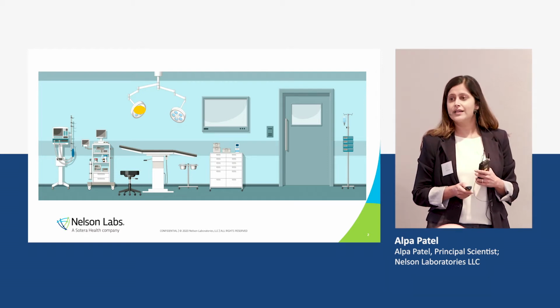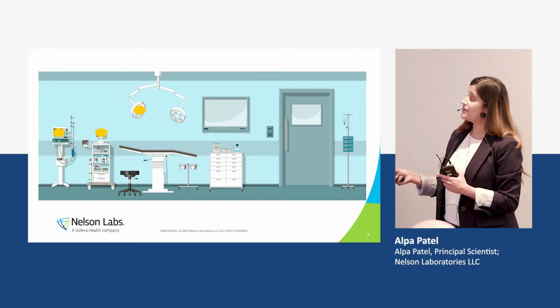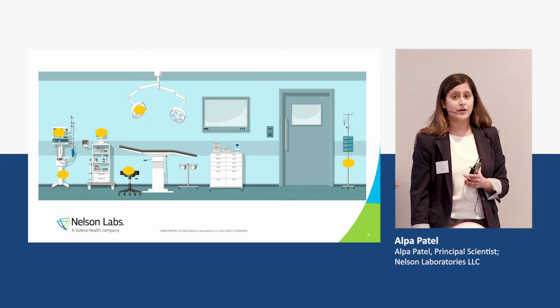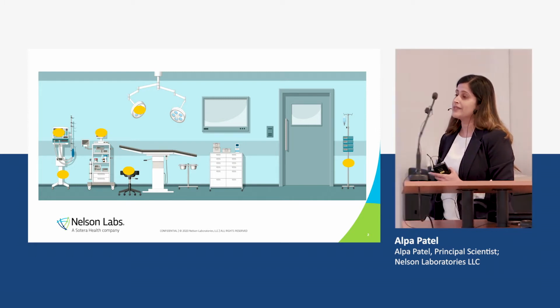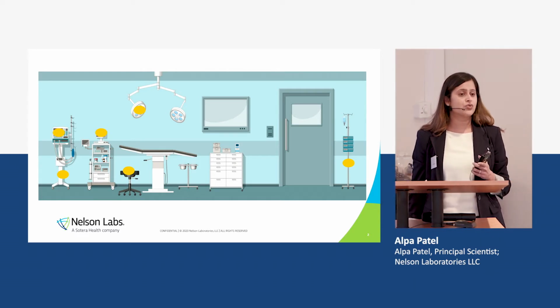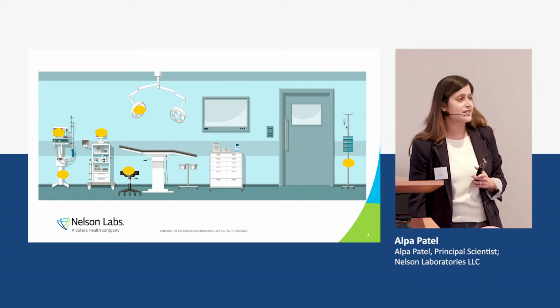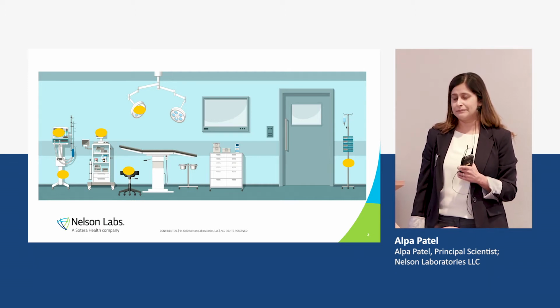Hospitals have internal procedures of how to clean all these type of devices in the OR room. However, are they validated? They're probably not. And so they go to the manufacturers and ask them. This is capital equipment that is placed around in the OR, or it's used for devices that are invasive. So we have seen an increase in the last 2 years on these type of devices that have come through for validations.